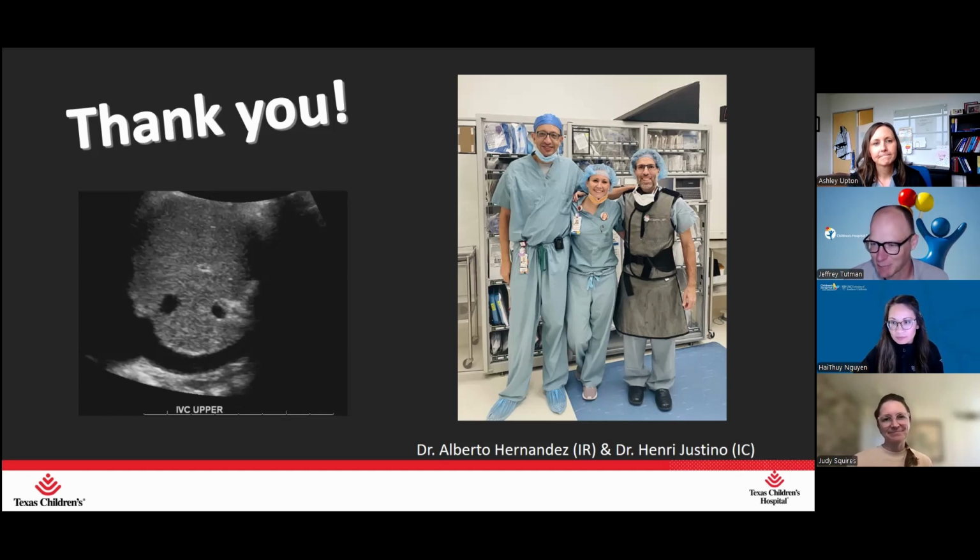Questions keep coming. If you have one measurement that's really far off from the remainder of the samples, do you count that one, or do you just repeat it so that they're all in a similar range? We have the capability of deleting one at a time. So I would probably take that one sample out and redo it, because more than likely it's an outlier. Okay, so you go through and try to get all 5 samples to be relatively representative of each other.